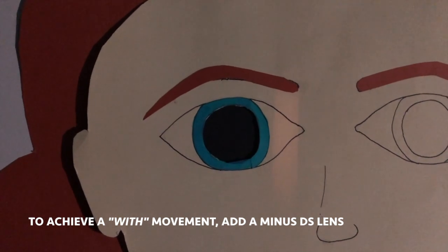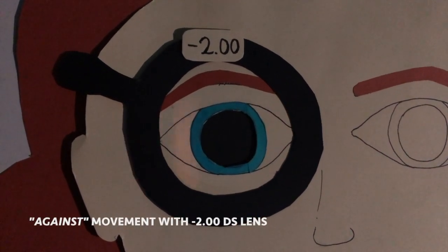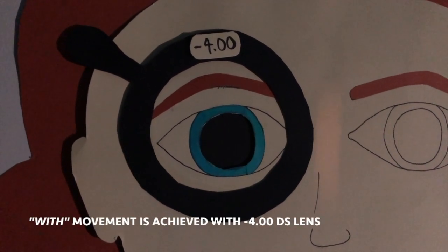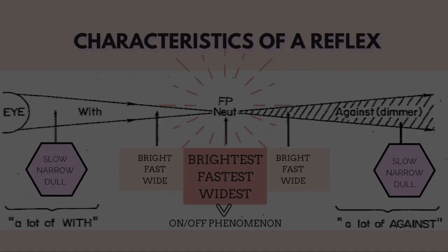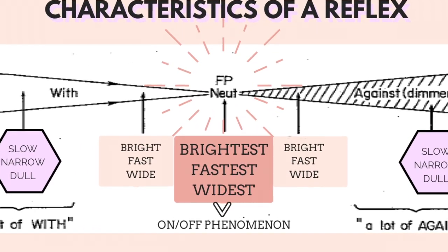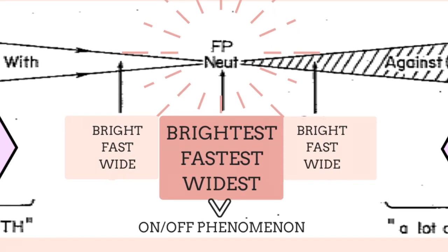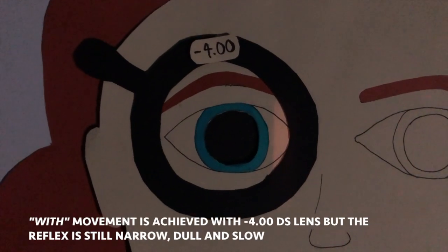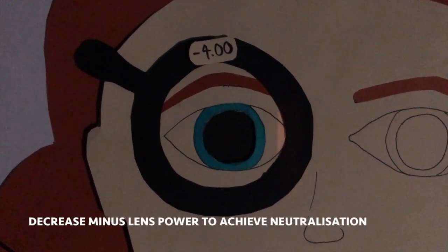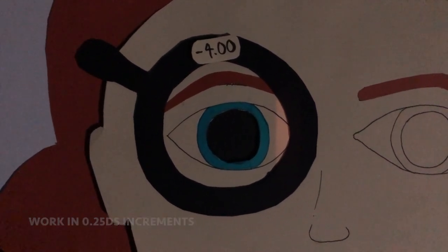In order to achieve a 'with' movement, the application of a minus lens is required. With the minus 2 lens, Ahelia still demonstrates an 'against' movement, so the minus power needs to increase. With the minus 4 lens, a 'with' movement is demonstrated. If the streak is close to neutralisation, it should be brighter, faster, and wider. Once neutralised, an on-and-off phenomenon should be seen where the pupil fully lights up. Since the reflex at minus 4 was narrow, dull, and slow, we need to decrease the minus power. We work in 0.25 increments, depending on the characteristics of the reflex.